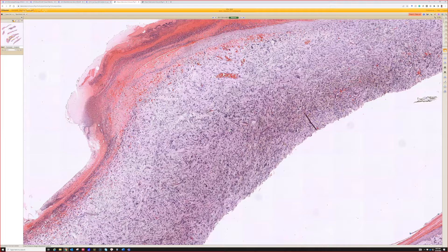They look like smooth muscle. They can have ugly atypical nuclei, but they usually have fascicles with eosinophilic cytoplasm. And most of the ones I've seen have been like on the trunk, I'd say. And so I feel like even though that's in there and it makes a nice acronym, in reality, I honestly don't usually consider leiomyosarcoma often in this differential.